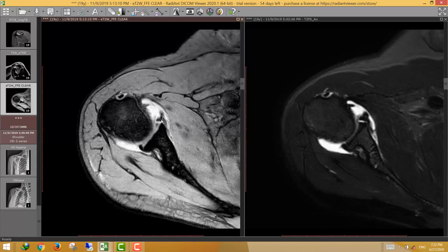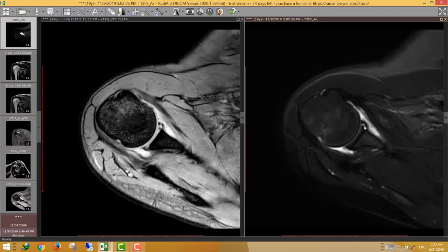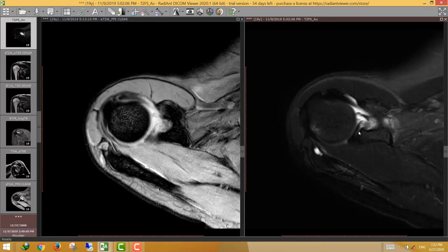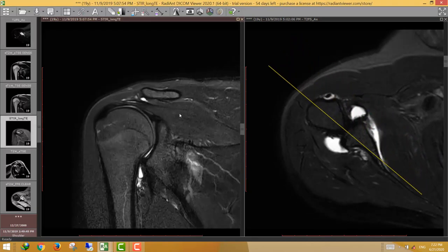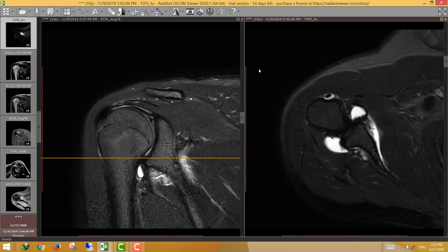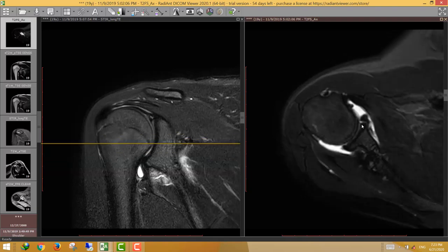The patient has a Bankart lesion with avulsion of the anterior inferior labrum and Hill-Sachs injury. Interestingly, the abnormal signal extends to the upper labrum. Going up along the anterior superior labrum, we see continuity of the abnormal signal along the anterior superior and superior labrum. This pattern is called an extended Bankart lesion — involving not just the inferior but also the superior labrum.